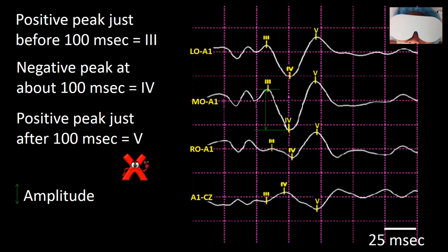Some neurophysiologists, I think most, consider a drop of 50% in amplitude significant, although I think that most would inform the surgeon of any change in amplitude and morphology occurring at a vulnerable period during the surgery. Latency is also monitored, but it is usually less reliable. In this case, latency was monitored from the stimulus to wave 4.